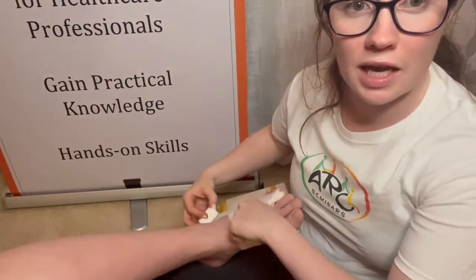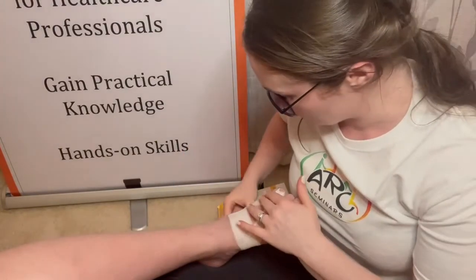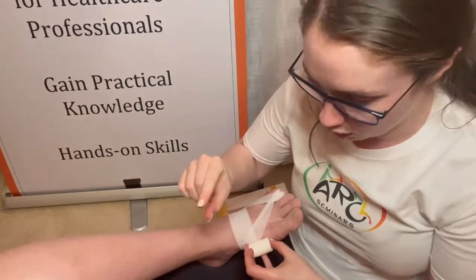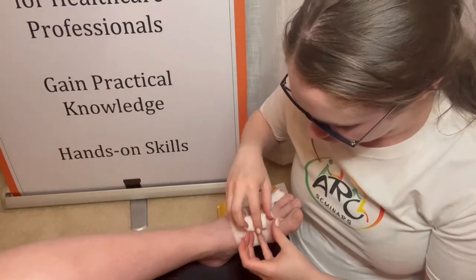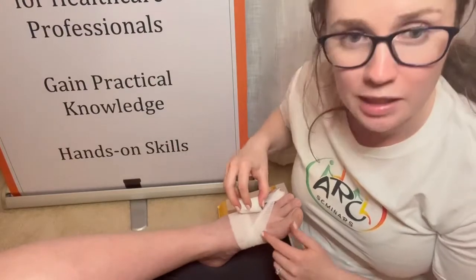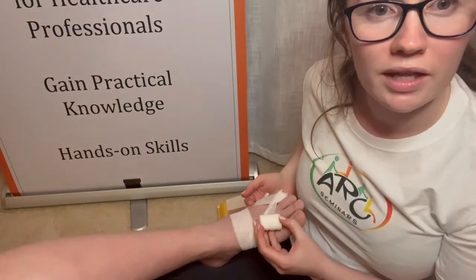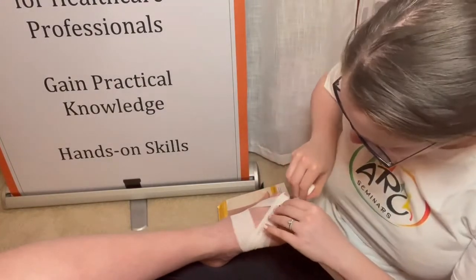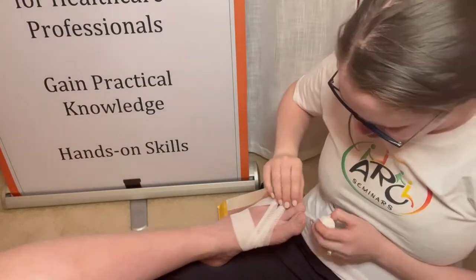Then I bring it at a diagonal back around the foot. I try not to keep going in this area as that can create a bar of gauze that can be uncomfortable for your person to step on. So I went a little bit lower, as you can see right there. And I'm bringing this back up. I'm going to fold the gauze again and get it on my 3rd toe here.